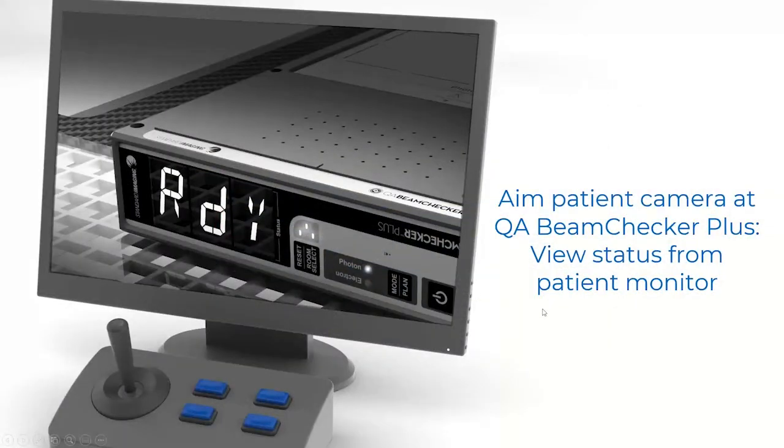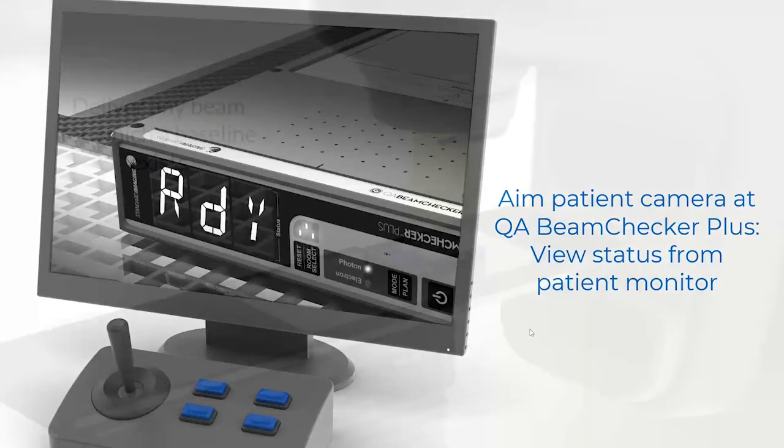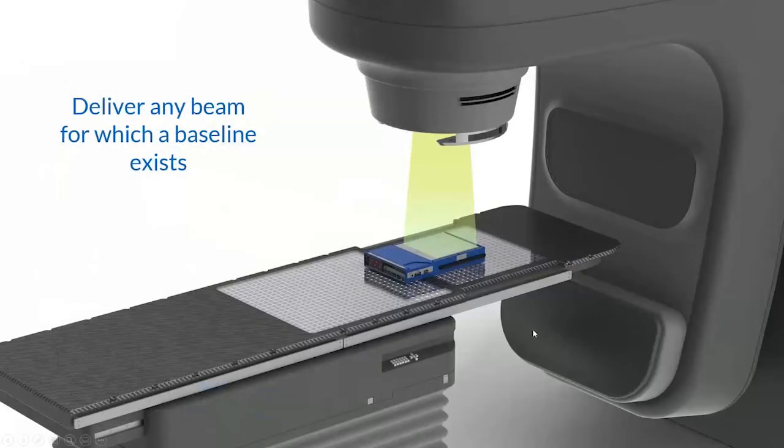Then you go back into the control room and aim the patient camera at the front face of the device. That is what's going to give you the information as a therapist on how I'm doing for each of my measurements. So I can see the status. I know that the device is ready to go. And then I simply deliver any beam that a baseline exists for on the device.